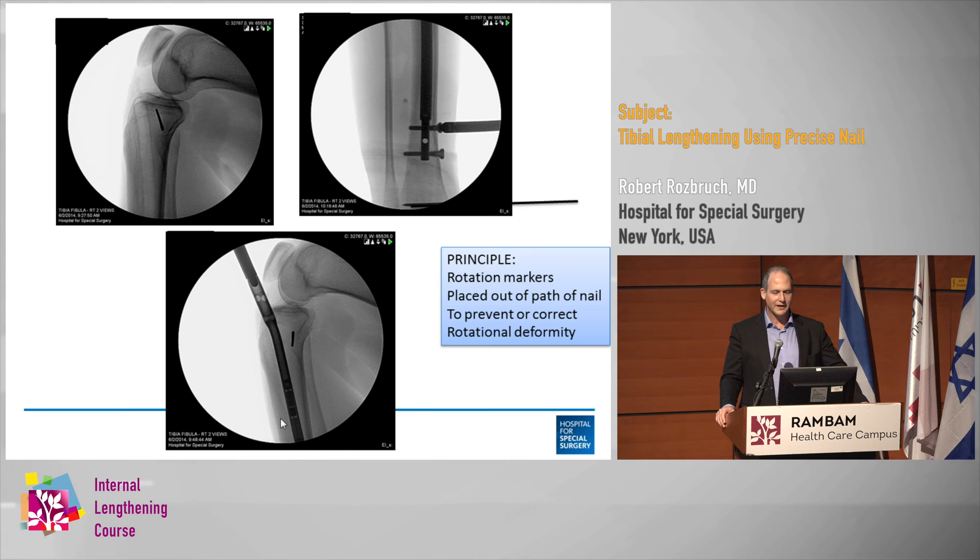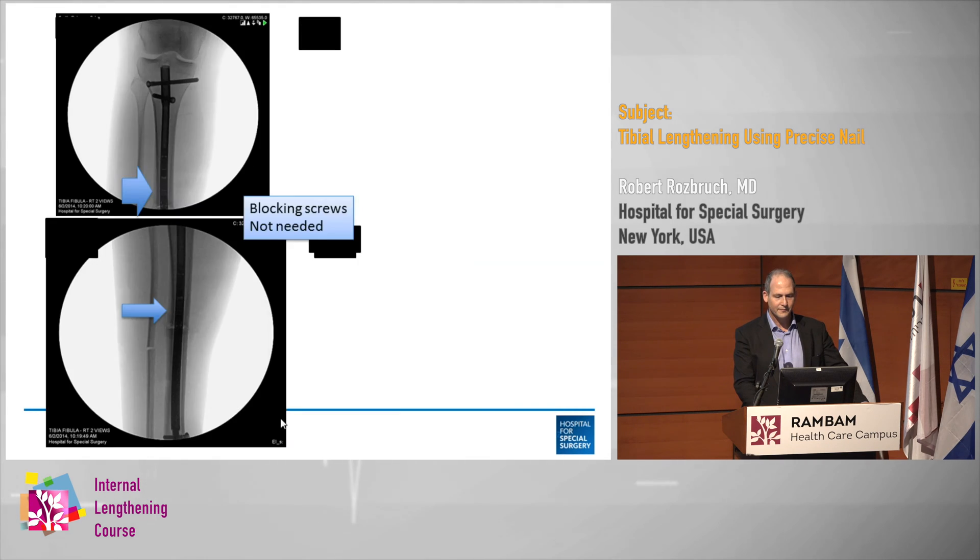These are some intraoperative pictures. You can see the rotational markers — I use Steinman pins placed out of the path of the nail. Proximally it's posterior, and distally it's just beyond the nail. In this case I decided that a blocking screw was not necessary, because the nail is basically sitting on the lateral cortex at the end of the case and it can't go into valgus. If there's no room for a blocking screw, it means you don't need one.